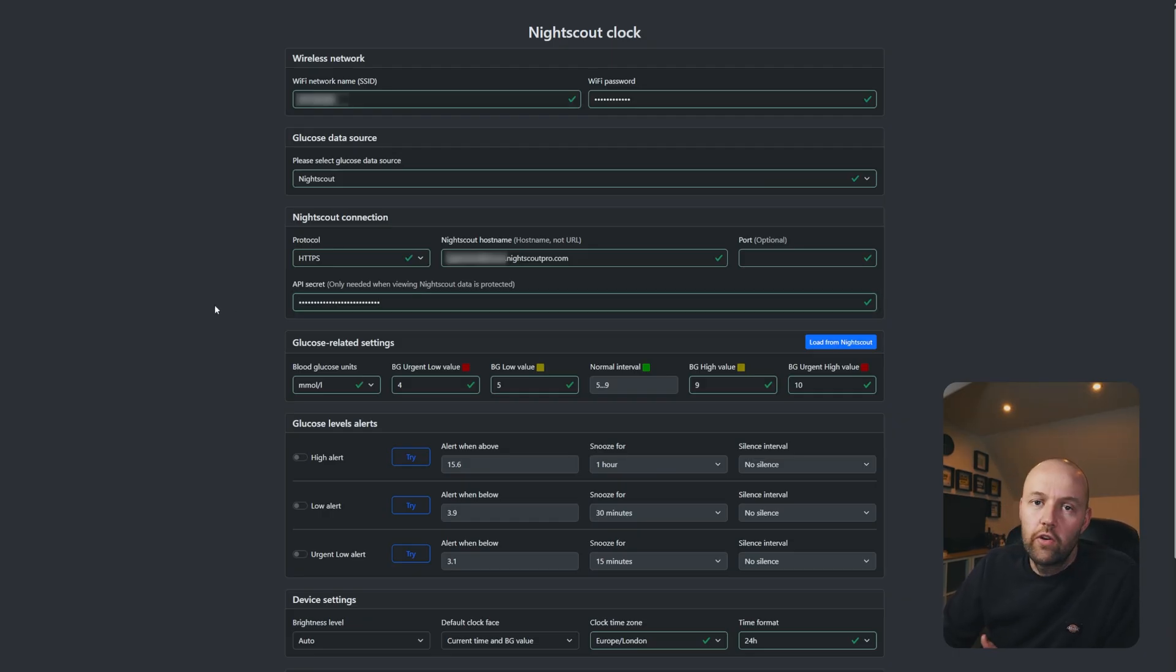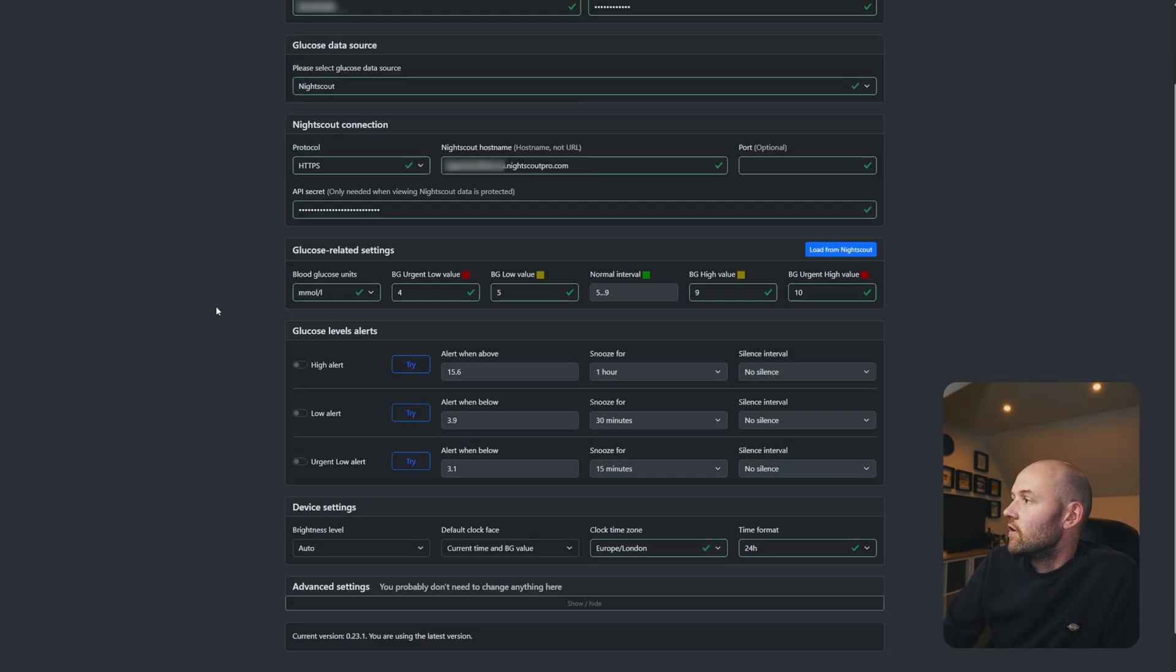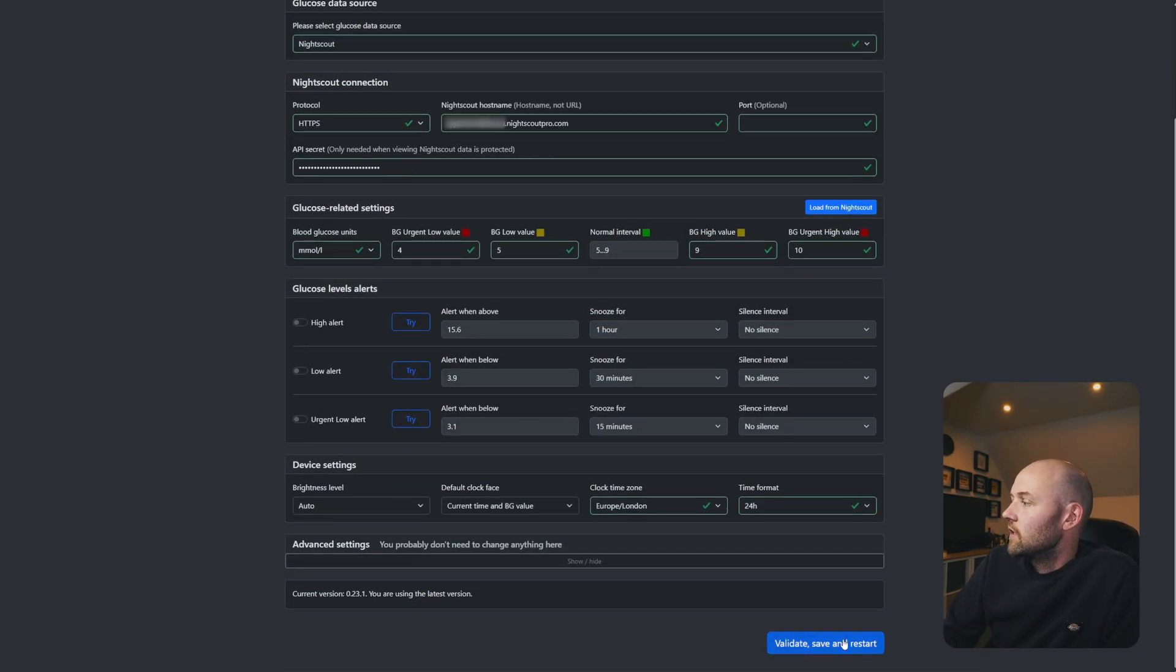So that's all you need to do. HTTPS, your actual hostname, and put in the API secret. If you now scroll down to the bottom, click validate, save and restart.